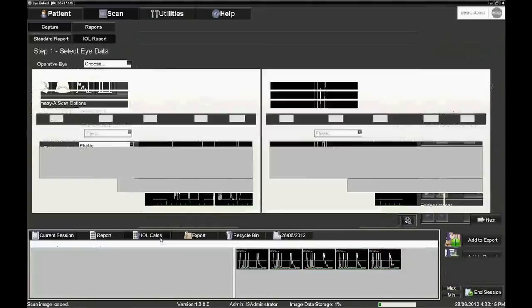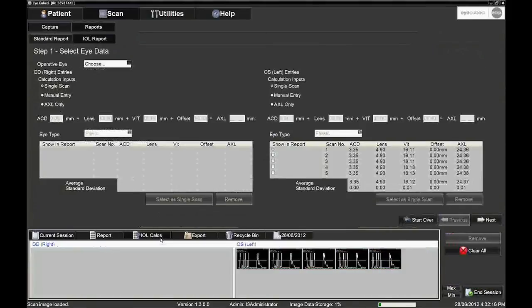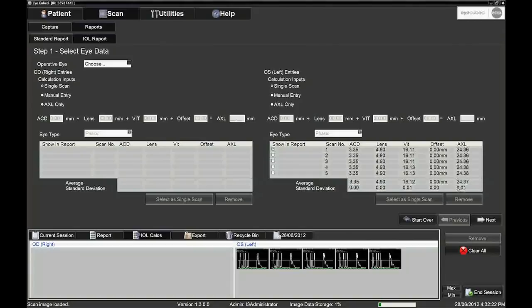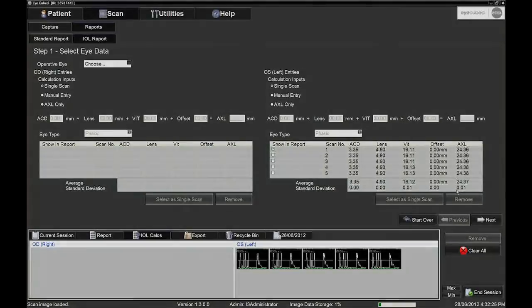The chosen images can then be used for the IOL calculations. It is recommended to always measure the fellow eye in order to compare the measurement, which should be within 0.3 mm.